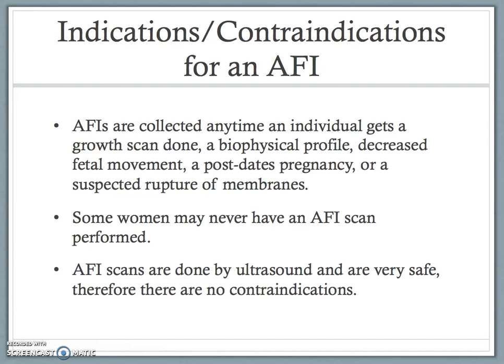AFIs are collected anytime an individual gets a growth scan done, a biophysical profile, decreased fetal movement, a post-term pregnancy, or a suspected rupture of membranes. Some women may never have an AFI scan performed during their prenatal care. AFI scans are done by ultrasound and are very safe, therefore there are no contraindications.